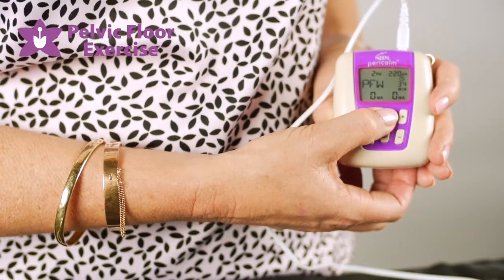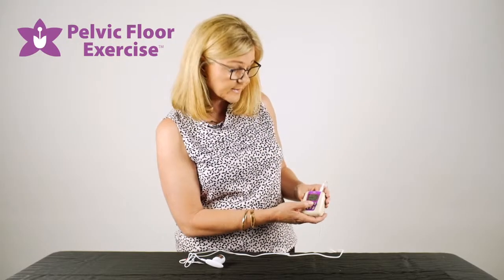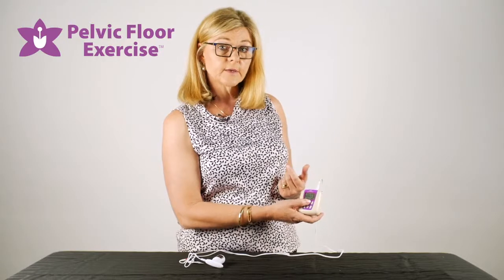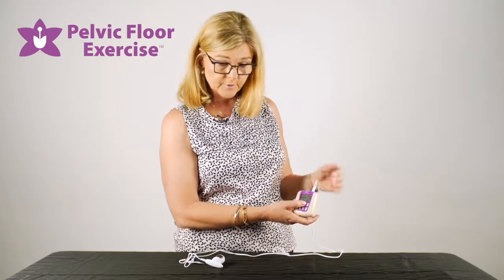Then there are a couple for urgency frequency and urgency relating to the bladder, and then there's a pelvic floor workout which ranges through various parameters. We also have memory one, memory two, and memory three — your health professional may have set an individual program in one of those for you and told you to use that particular program.